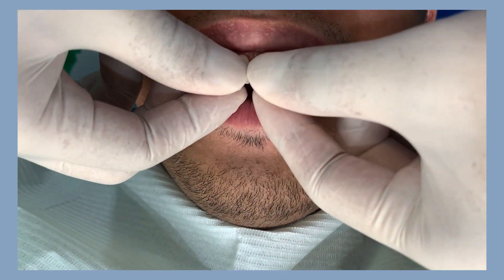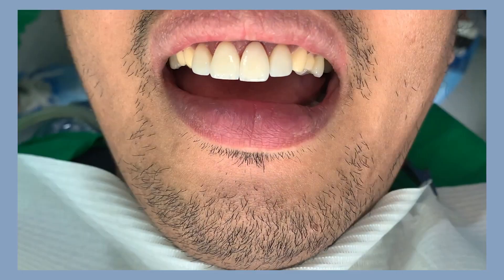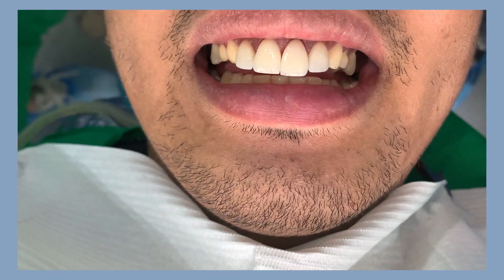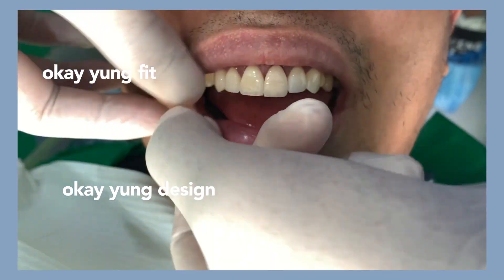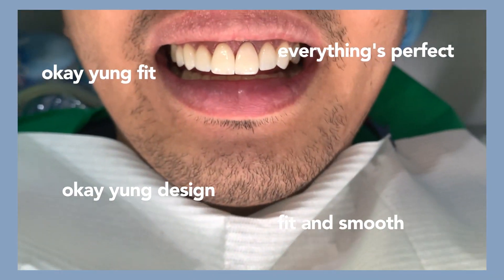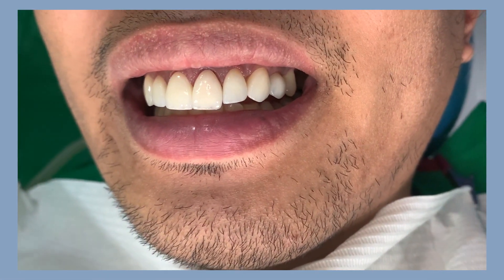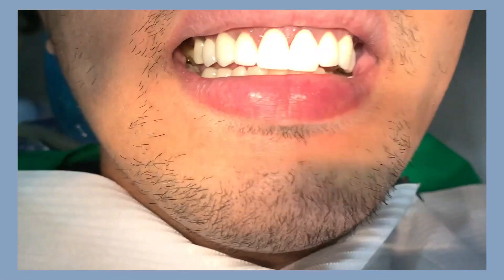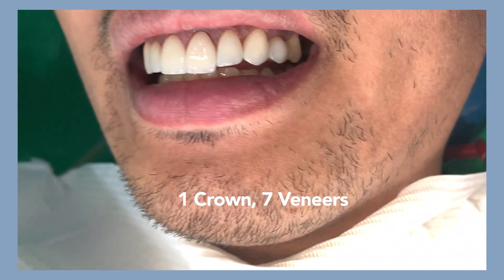We did a try-in after a week. We made sure everything was okay because we don't go straight to cementation — we need to make sure the fit is okay, the design is okay, and everything is perfect, fit, and smooth before we do the final cementation. And here is the final outcome of the combination of one crown and seven veneers.